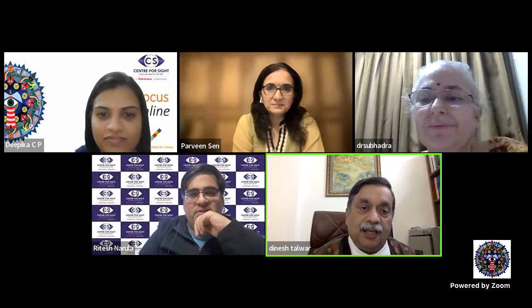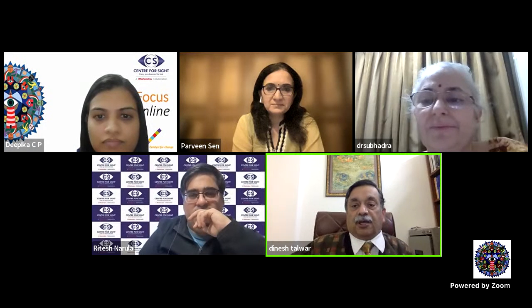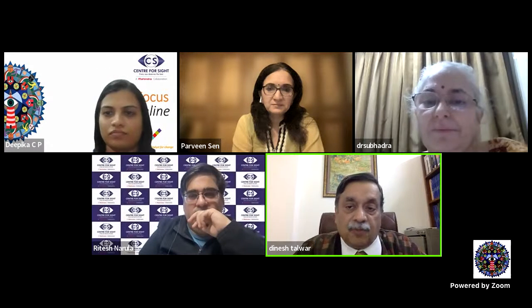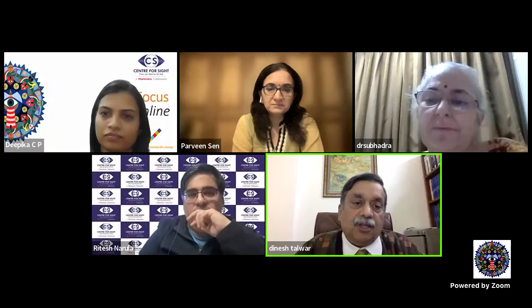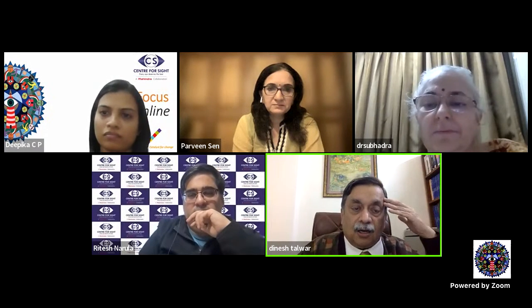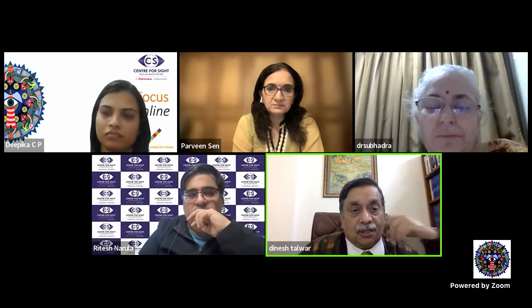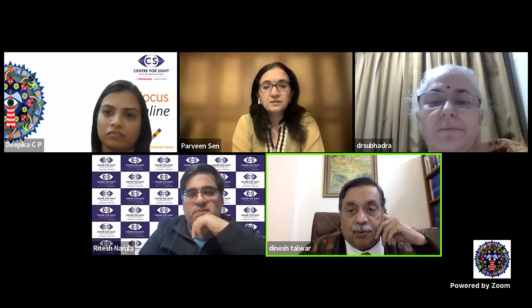I think multifocal ERG is something that we covered very well, and we all need to be aware of that. One good thing where we sometimes miss is that we end up doing the multifocal ERG, but we must remember to get the normal ERG done, specifically when we are thinking in terms of a global disease. Then I think both are important. In chloroquine toxicity, maybe we could go ahead with just multifocal ERG as a routine, unless we have a problem there.